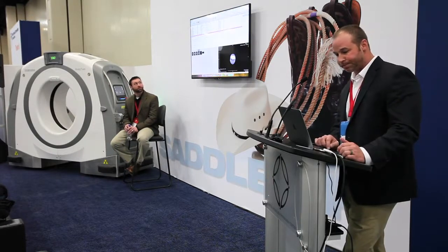And that can be in a skull. So if we're looking at, let's say, a late age horse that you're wondering whether it's a dental origin or a neoplastic origin, that's going to be a real challenge to differentiate on the cone beam CT versus our fan beam CT. So the ultimate, though, you're going to get a soft tissue sample to diagnose the disease process anyways. But your list of differential diagnoses opens up a fair amount when you're looking at the two different technologies.